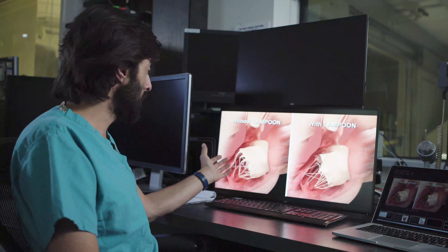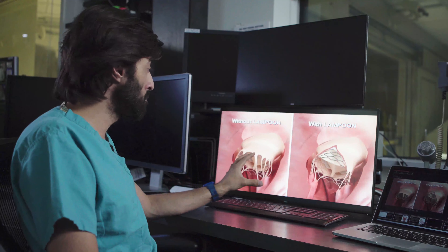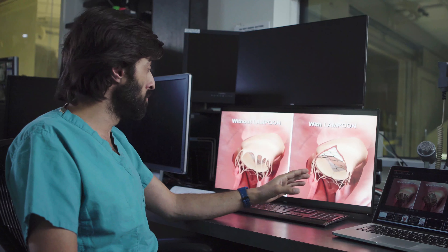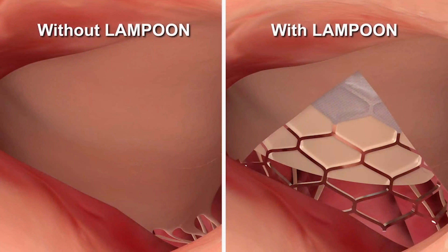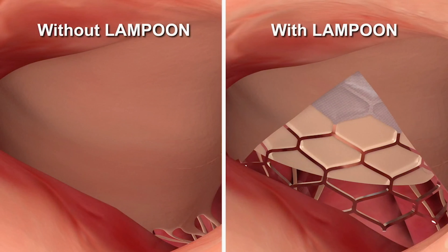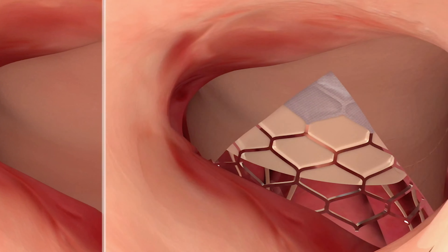Here it is — the transcatheter mitral valve is implanted in position: on the left without Lampoon, and on the right with Lampoon. If you look down the barrel of the left ventricular outflow tract, you can see this is completely obstructed and this patient would not survive.